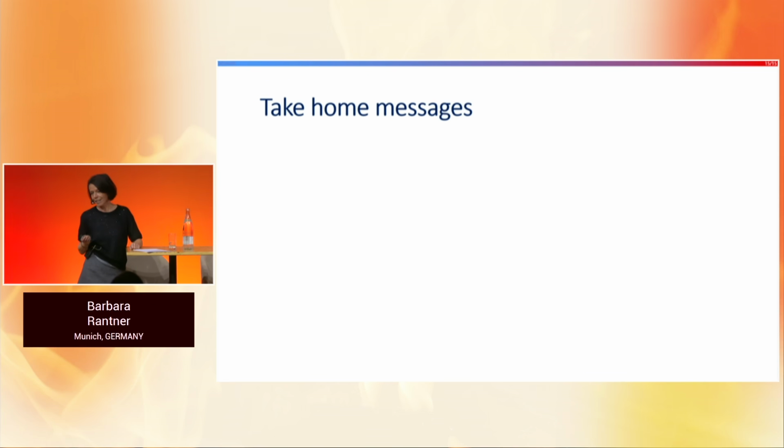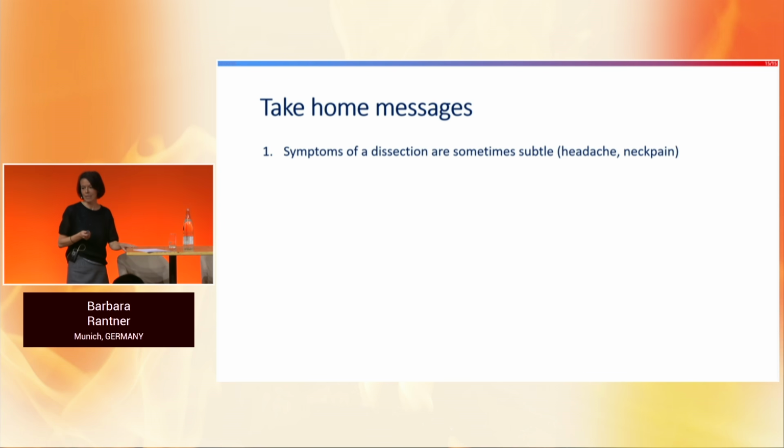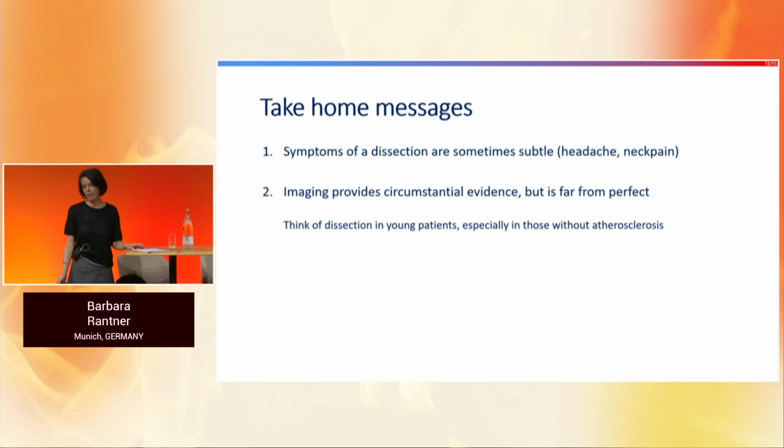Wow. So in summary, that was my case. We always need to keep in mind, especially in young patients, that it might be from an extracranial carotid dissection. MRI and MR imaging might be the diagnostic performance of choice, because it's not that easy to see it in the ultrasound and also CT angiography.